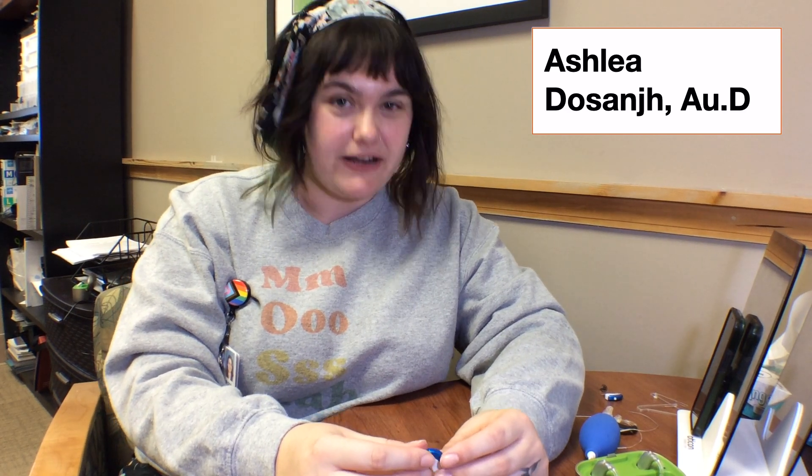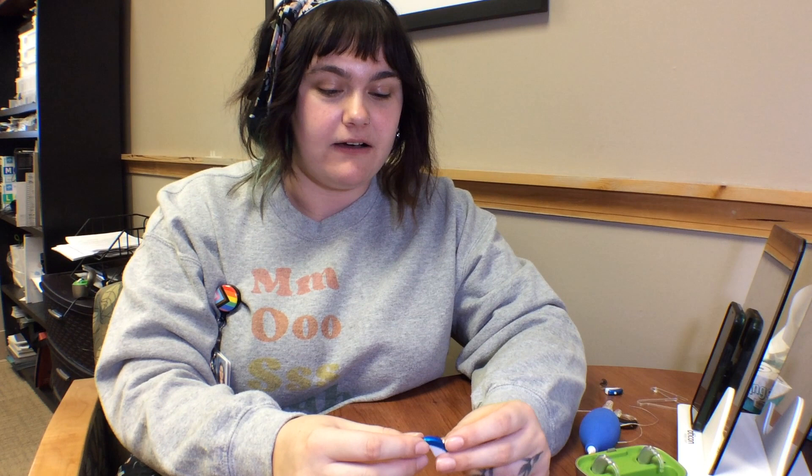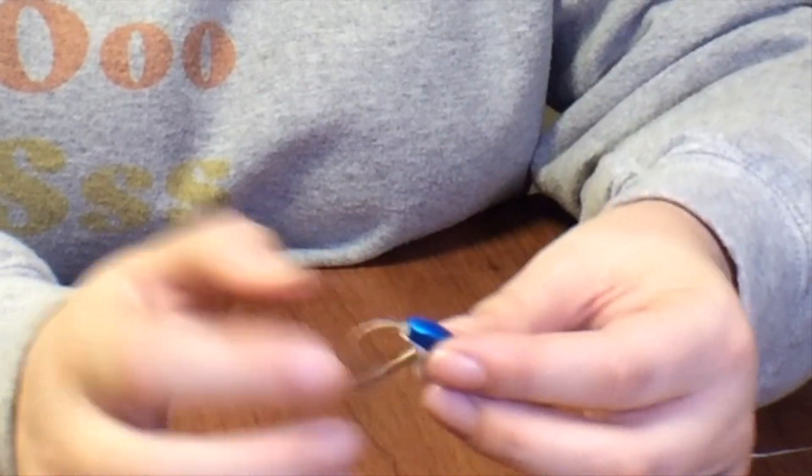I'm Leah Dessange and I'm an audiologist, and today we are going to be doing a listening check on a RIC style hearing aid. A RIC style hearing aid is a receiver in the canal — as you can see, there's a wire here.